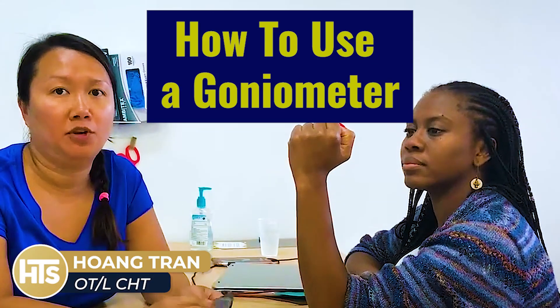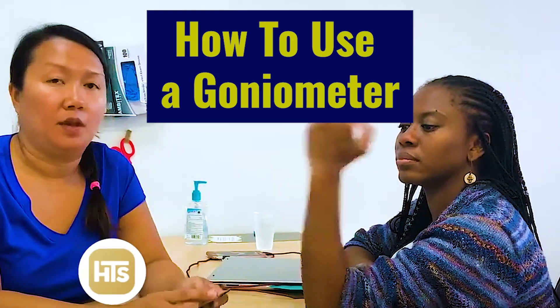Hey, it's Wong. I'm going to go over some goniometry measurements, how to use a goniometer here at the clinic. I know that you may have practiced it before you came, but we like to make sure that we're consistent with how we're measuring so that every single time we measure, we're getting the same results and we're consistent in our methods.